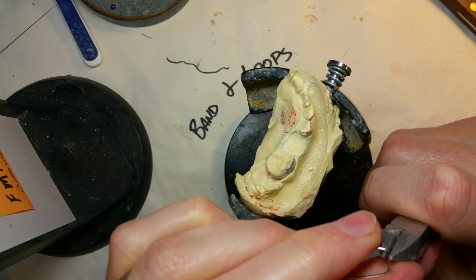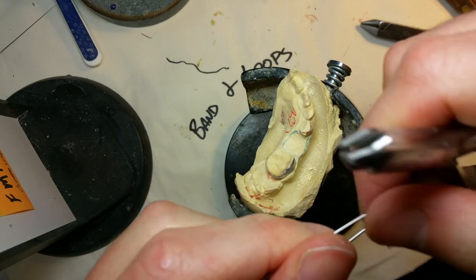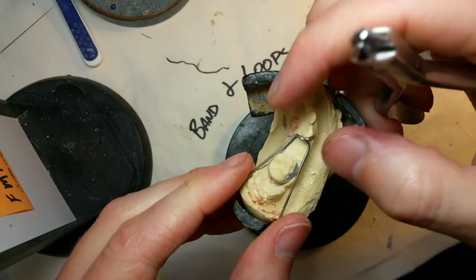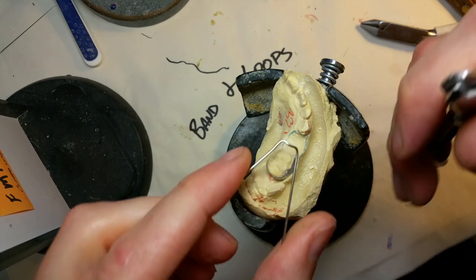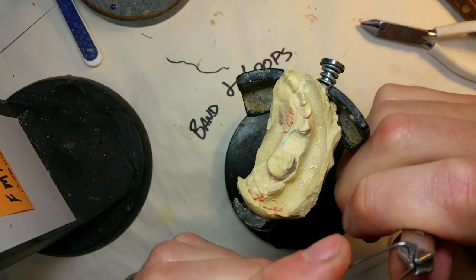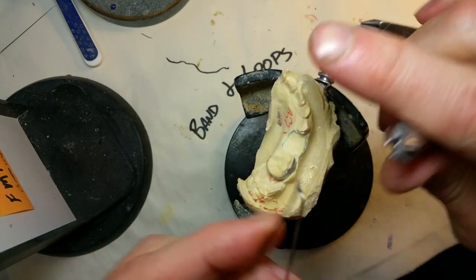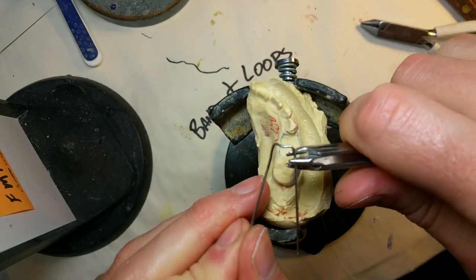A little history on these — they are space maintainers. You can see how I'm contouring it to the arch to make it more comfortable, doing an hourglass shape to get them away from the cheek and the tongue. If you get them stuck out too far, it'll irritate the cheek and the gum. I like to contour them in, but not too much. You still want to leave room for that tooth to grow in, and once it does, the doctor will remove the band and loop.